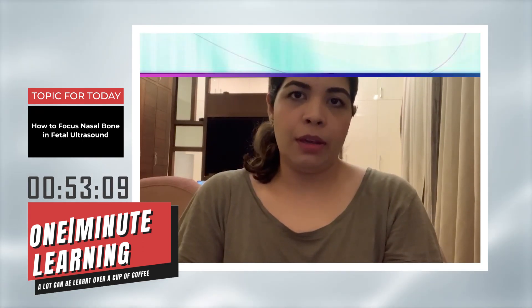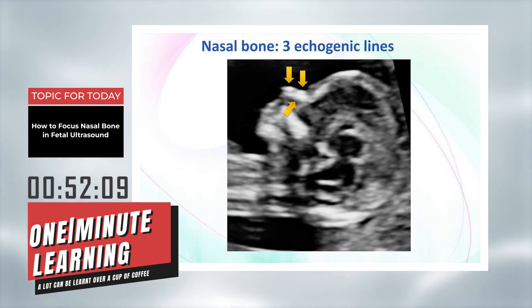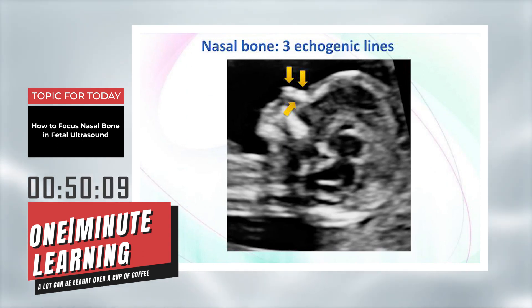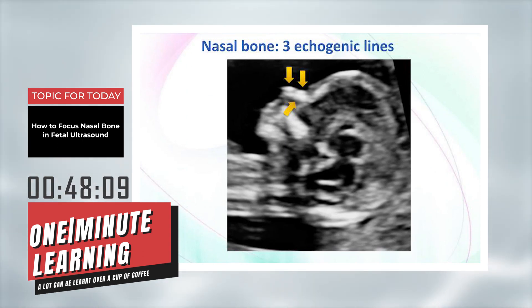Nasal bone in the first trimester serves as a marker for various aneuploidies, especially trisomy 21. We all know about the mid-sagittal view and the equal-to sign to determine the nasal bone.